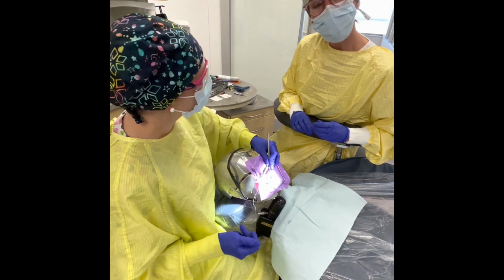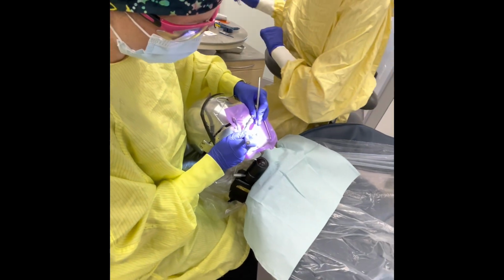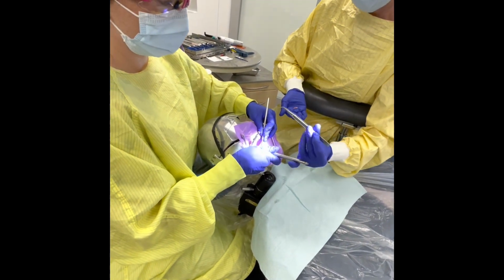Now what we're going to do is start the Tofflemire sequencing. So we're going to start with the Explorer. And then of course we place a wedge. What wedge would you like? I'll take the orange wedge. Orange wedge? Okay. I'm going to take the Explorer.